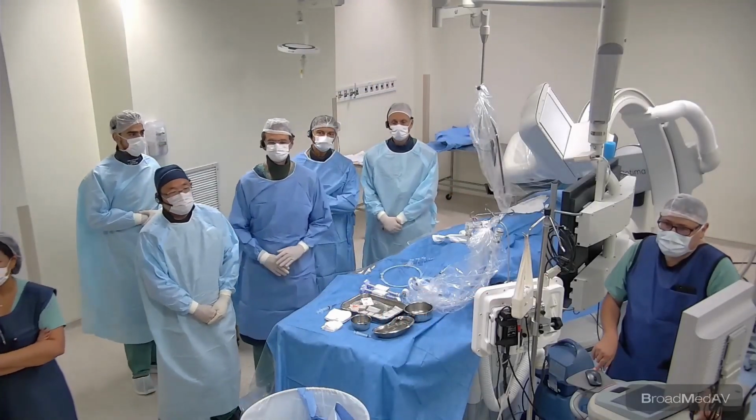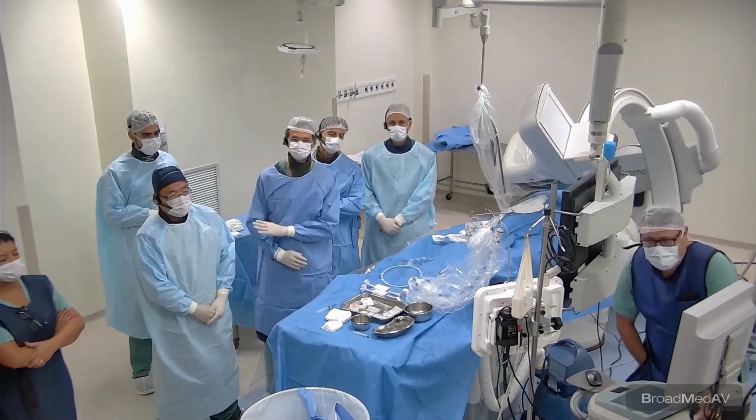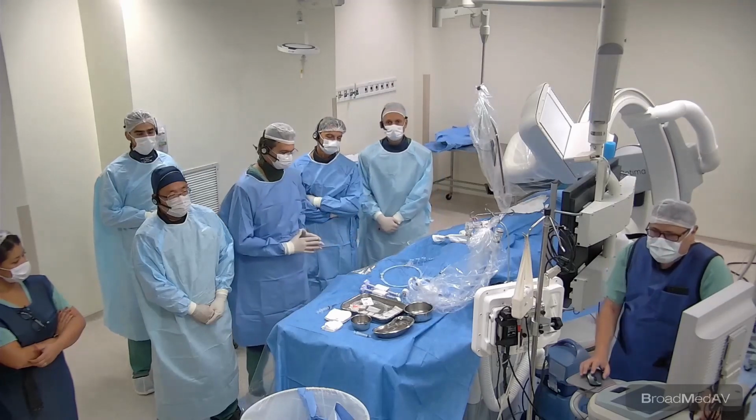Okay, great. This is Fausto Ferres again. I just moved from lab 1 to lab 4. We were in the valve heart case. Now we came to a coronary case.